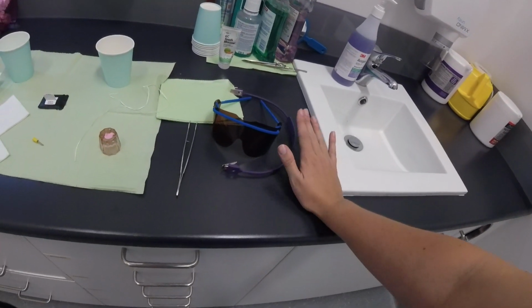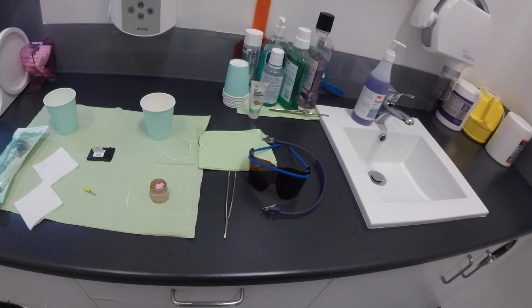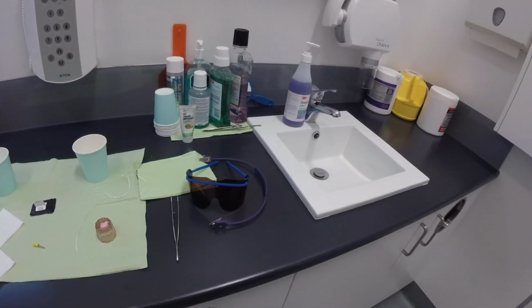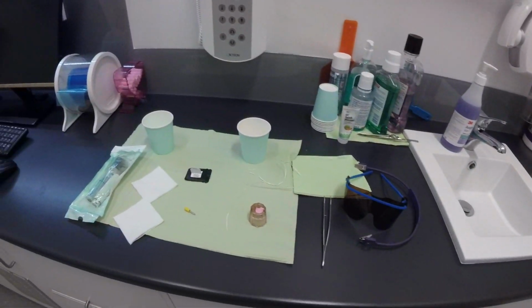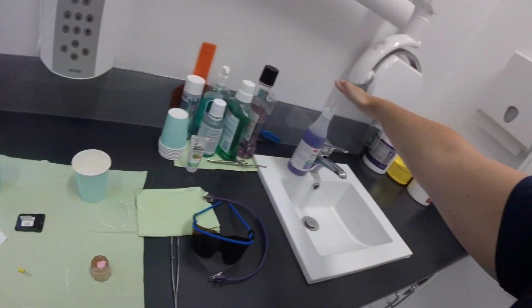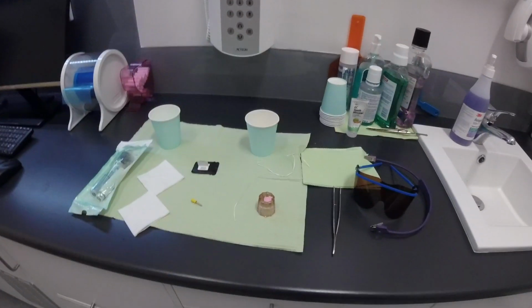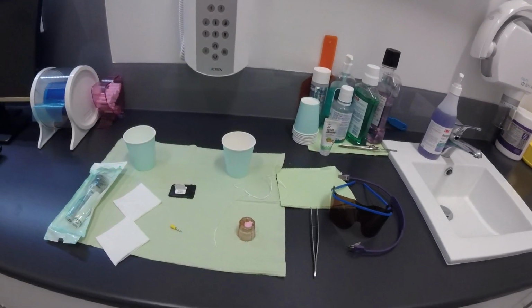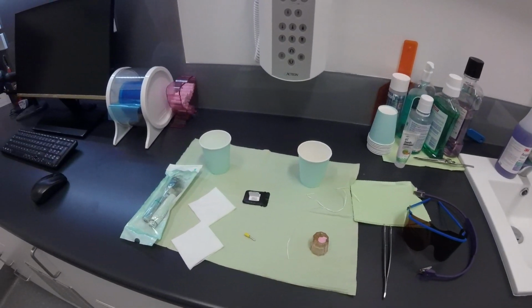I give them the patient glasses. I say, here, just pop these ones on. And they do. Sometimes patients have their own safety glasses. They've just got to be wraparound. That's all. So if any splatter or contaminants got in their eye, they were protected. And it does happen. When the patient comes in, I like to make a point of using either the hand wash, which is over here, or the micro shield. I like to make a point of washing my hands while the patient's entering or getting seated, depending if you're bringing your patient in.